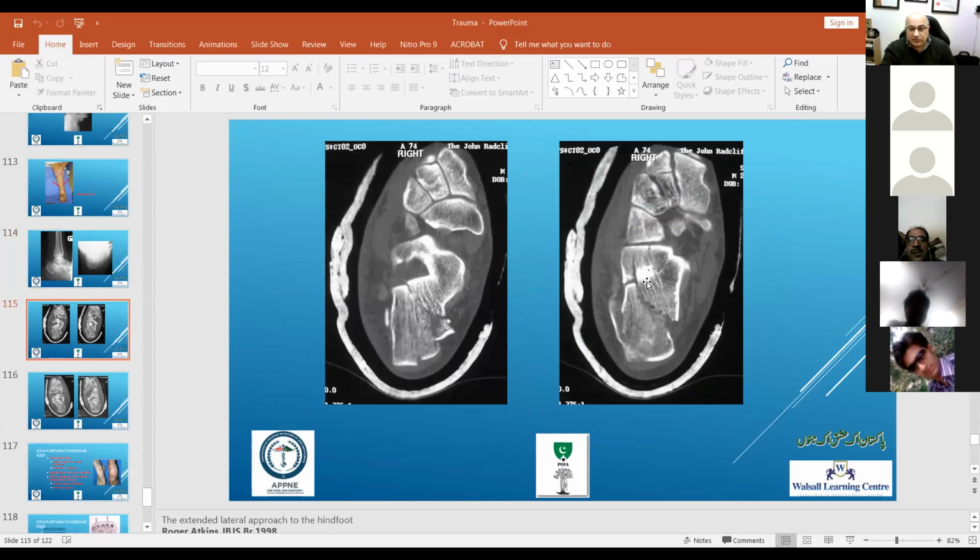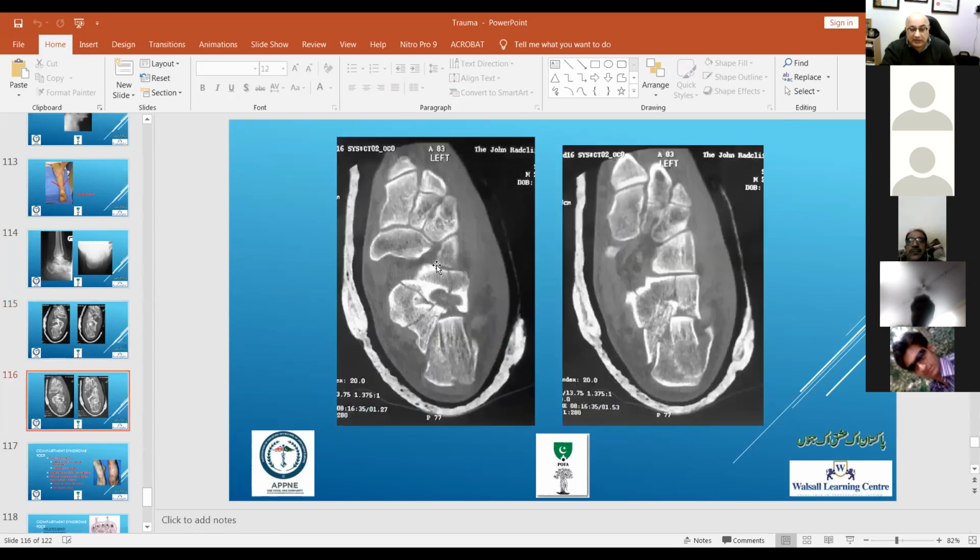Okay, sir. So what joint is this? Calcaneocuboid is okay, isn't it? It's maintaining itself. Although there is a big nasty fracture, the most important joint is intact. It's working, right? And the sustentaculum tali is also intact. Can you see that? It's one big piece. And if you look at this particular picture, although this is a nasty fracture, would you think you can leave this as non-operative management?